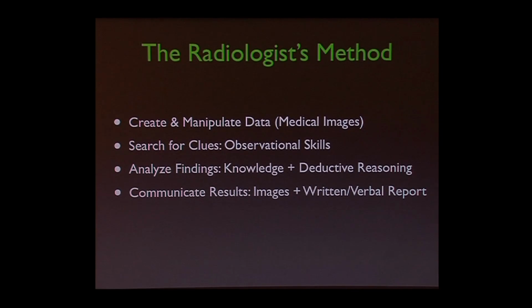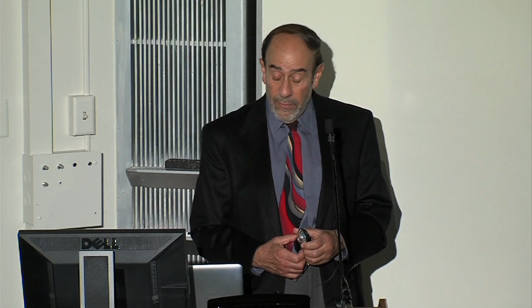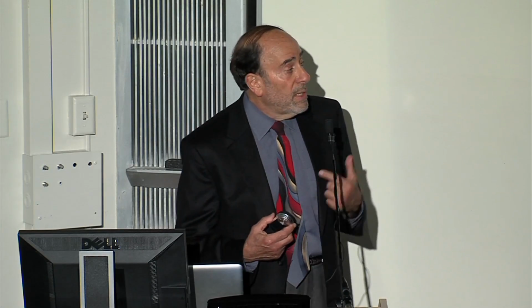Our method is to create and manipulate the data, the images, get as much information as we can from it, and search for any clues. And sometimes they're very, very subtle. So we need to be good observers, and we need to know how to analyze the findings, both with our knowledge and our sort of deductive reasoning as to what those little clues might mean in that patient's clinical setting. And also, we have to be communicators. Communicate our results so that they're most useful to the doctors taking care of the patient.